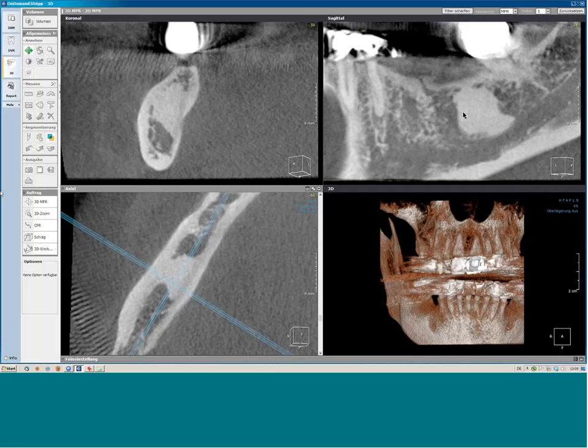Somebody is saying to me that it would be nicer to just remove all the material and put some bone augmentation material or bone replacement material there. So you can imagine if this will work or not. I don't know, I can only tell you this is a situation where I won't recommend to put an implant in there.